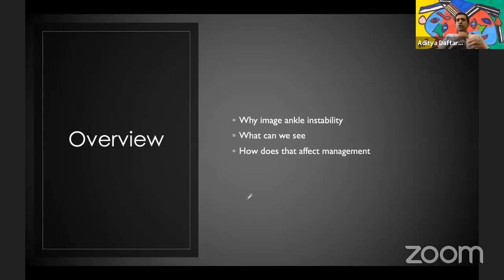So having gone through that basic anatomy of what we see on ankle MRI, I'm going to talk about why we image ankle instability and how MRI helps us do this. We're going to talk about what we can see and how that affects management.